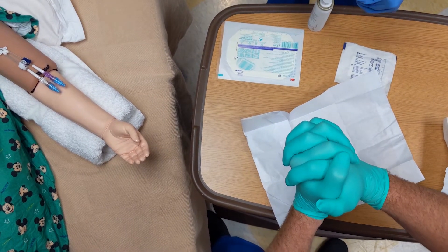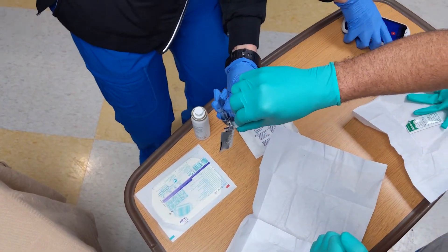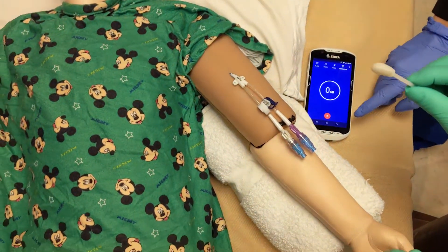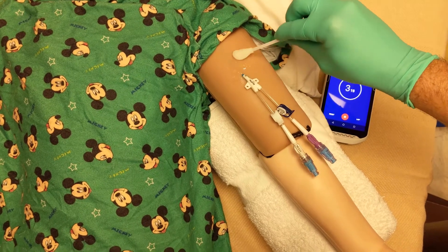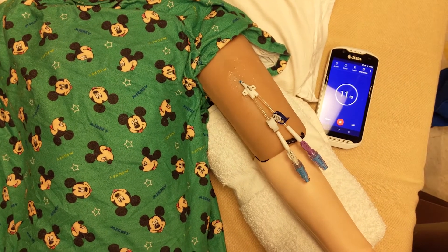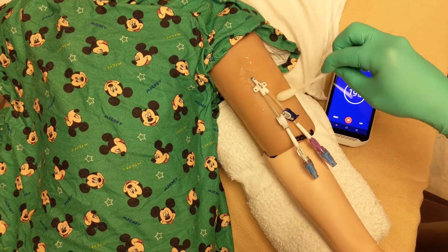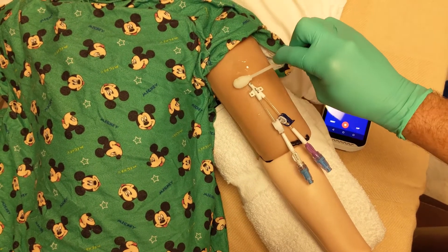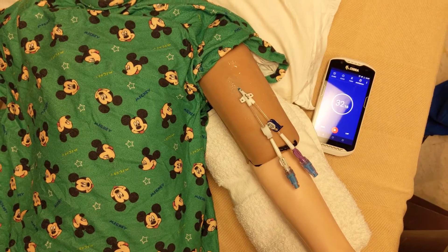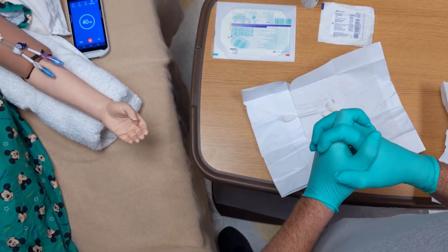Now that you're sterile again, have your second person open the chlorhexidine swabs or whatever materials you have that contain CHG, and grab one without touching the outside of the package — that's how you remain sterile. The contents inside the package are sterile, so it's okay to grab the swab. Use each swab and scrub for 10 seconds. You don't have to do it in a circular motion with CHG; you just want to scrub well from the center out. Discard the swab and use the next swab for 10 seconds, then the third swab for 10 seconds. Allow the site to dry for a full 30 seconds — it's very important to allow the site to dry completely because the CHG and alcohol drying is what actually kills the bacteria.